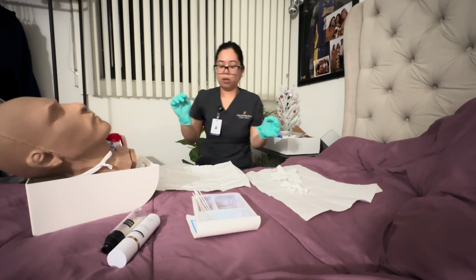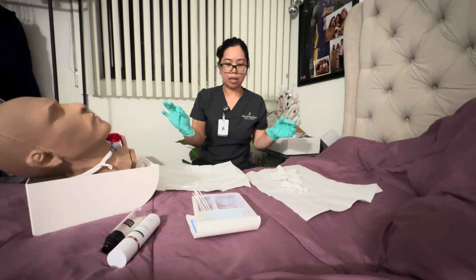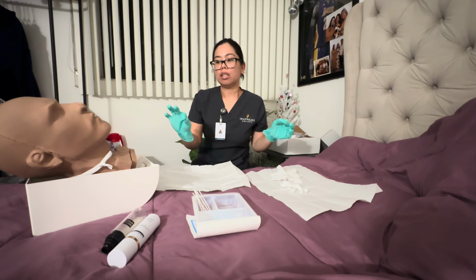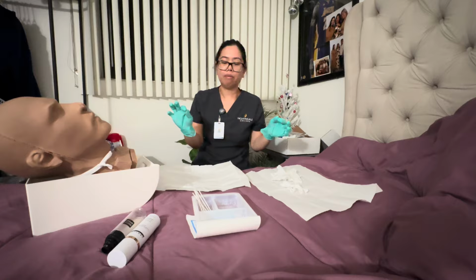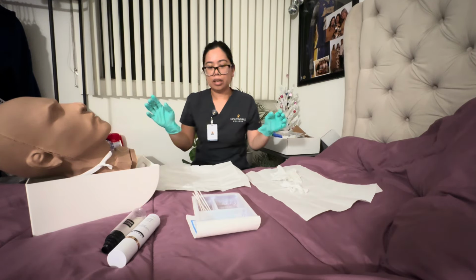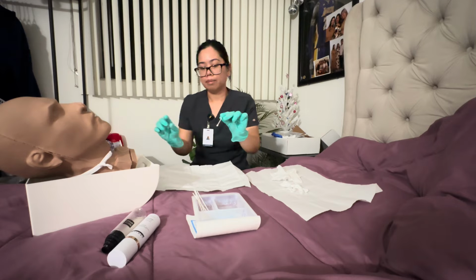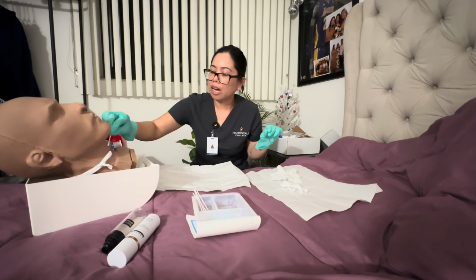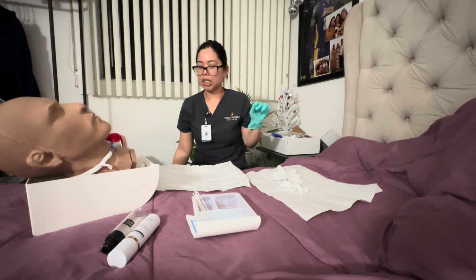Okay, the same curve for the patient. So now that we've done that, we're gonna go ahead and clean around the stoma area, behind the flanges, the faceplate. So that's what we're gonna do. I'm gonna go ahead and get my sterile applicator and clean outward around the stoma, and then discard it.